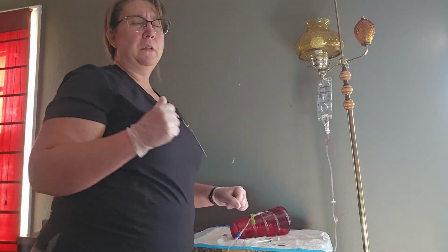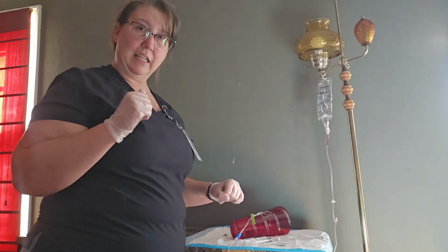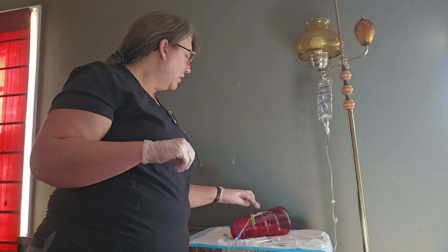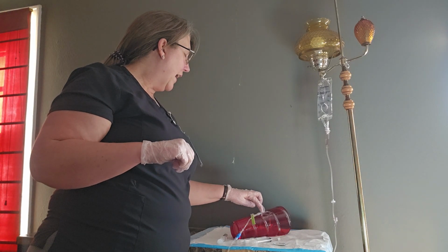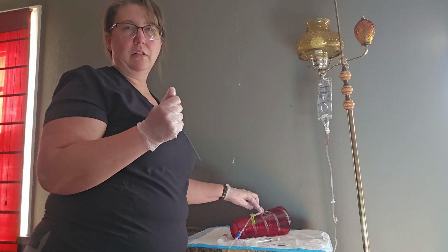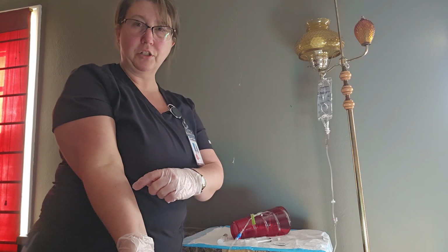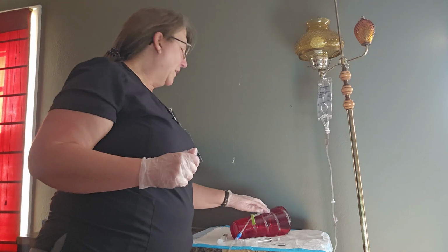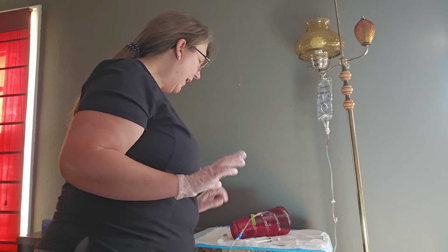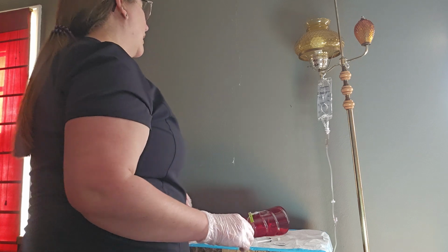Now, whenever I was putting the medication into the IV site, I was looking at the patient's skin. I was seeing if there was an immediate reaction that I could see at the point of the venipuncture. And with this patient, I did not see anything, but that's very important. Now I have reattached the patient back up to their IV.